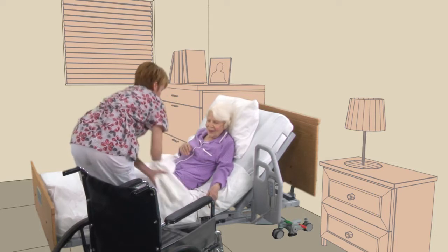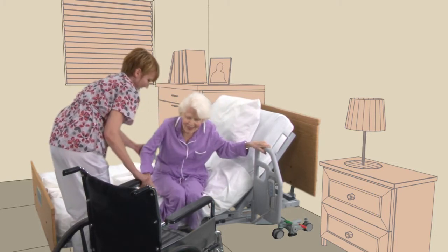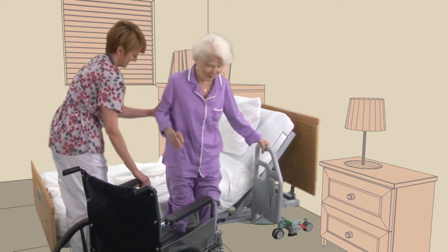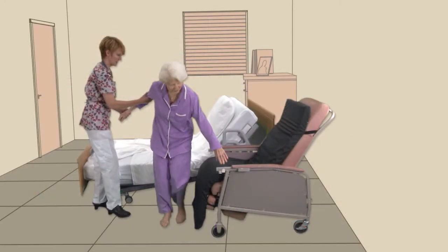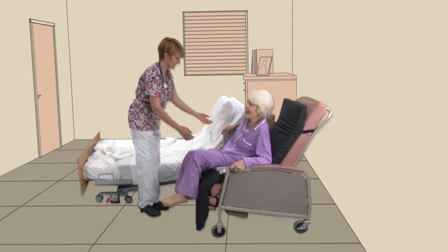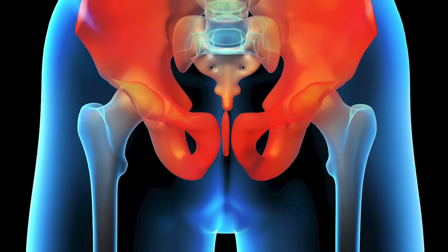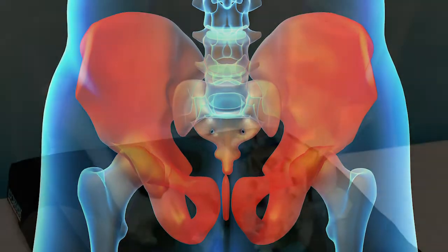It is also important to think about safety when patients are ingressing and egressing. Be sure the patient is stable, whether sitting or standing, before the next step to decrease risk of falling. Clinical considerations when patients are sitting or the head of the bed is elevated are: pressure on the sacral ischial area is increased while sitting, so reposition the patient often while up in a chair.